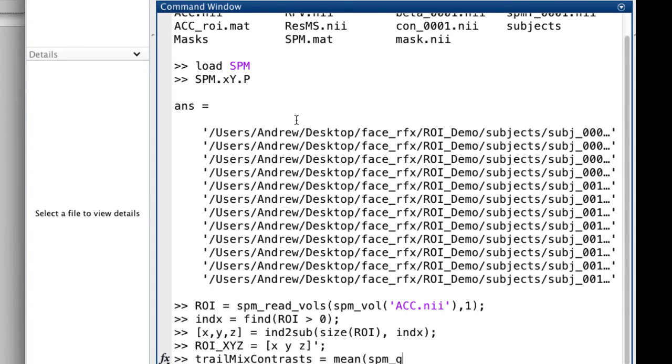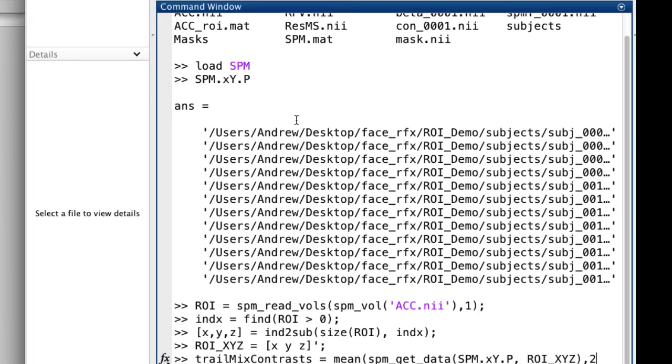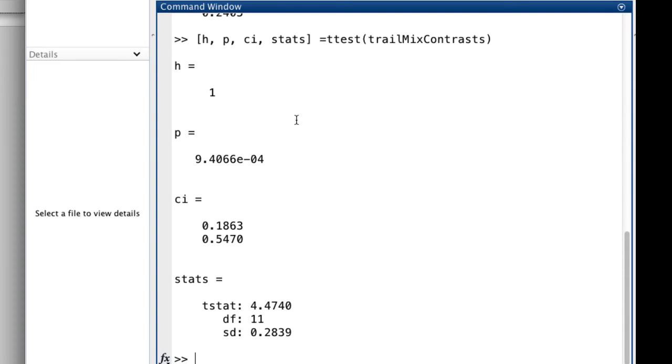I can then put this in a variable, such as trail mix contrasts, and then submit that to MATLAB's ttest command. This will return the p-value for that ROI analysis, along with the t-statistic that you can report in your paper.